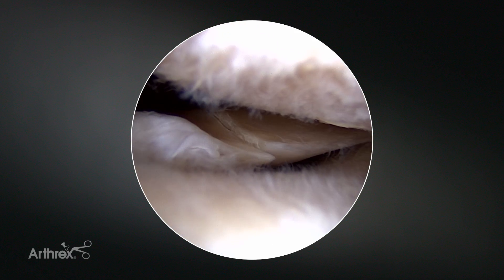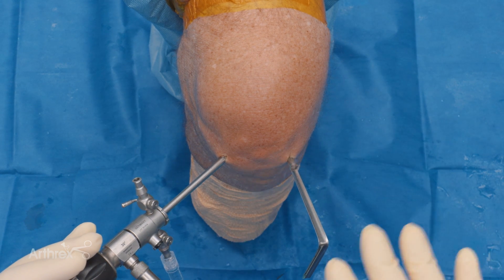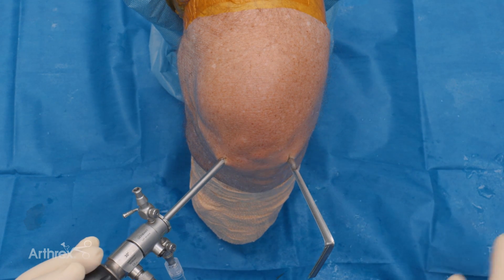The new 1.5 fiber stitch comes in straight, 12 degree, 24 degree up, and then a reverse curve. The choice of those is very dependent on the tear type and the actual access you have to get to whichever meniscus you're repairing.